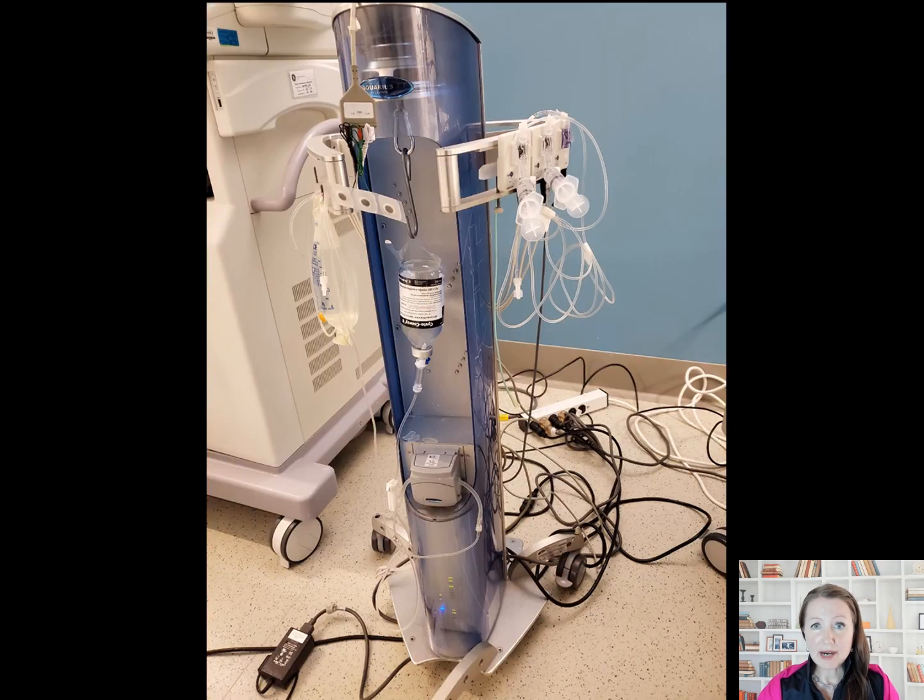Here you see the urodynamics tower prepared with transducers for the P-Abdomen and P-Vest, urodynamics measurement tubing connected to each, radio-opaque dye connected to the infusion tubing, and the EMG patches prepared for attachment. An extra bag of sterile saline is available if infusion volume is high.